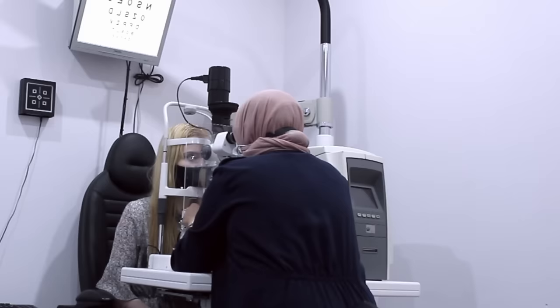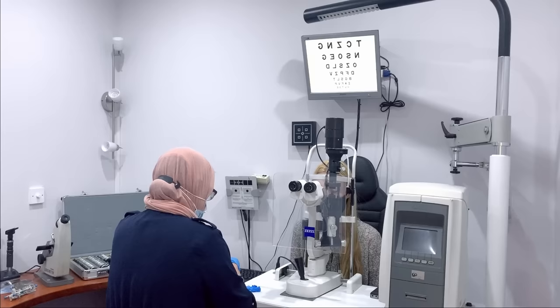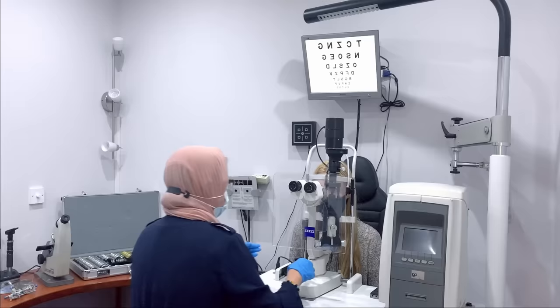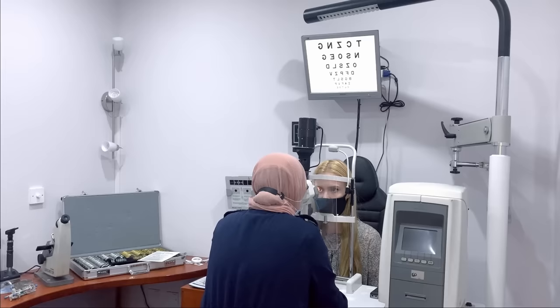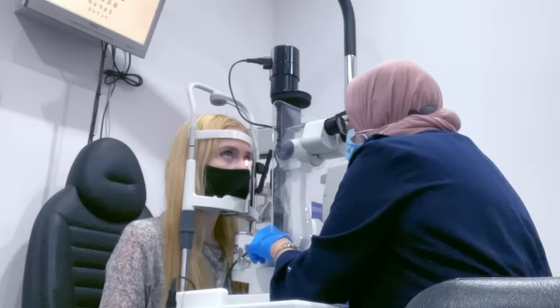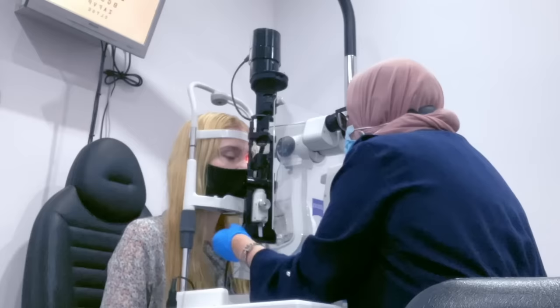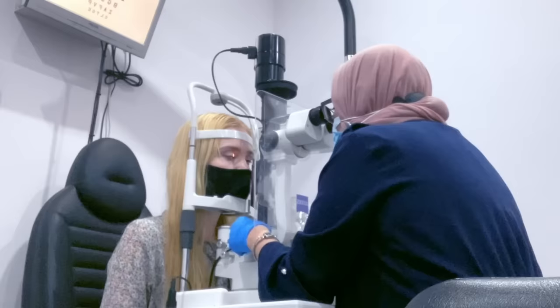That's great. At the moment, I'm just looking. Great. So I'm just going to pop my gloves on. Right. Just look straight ahead for me. And look up to the ceiling. That's great. I'm just going to pull it down, okay? I'm just going to lift your head up a little bit. Is that okay for a bit? Look right up. That's perfect. Look down. Great. Look straight. Good. Look up again. Keep your head forward as much as you can if you don't mind, yeah? Look up again. And look down. And look straight ahead for me. And look down for me.